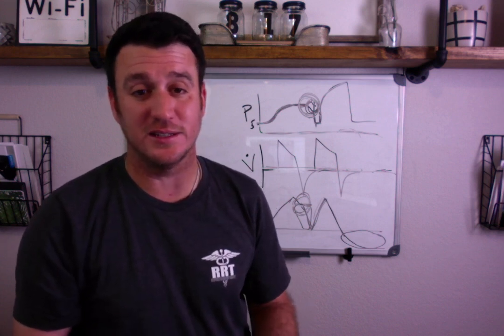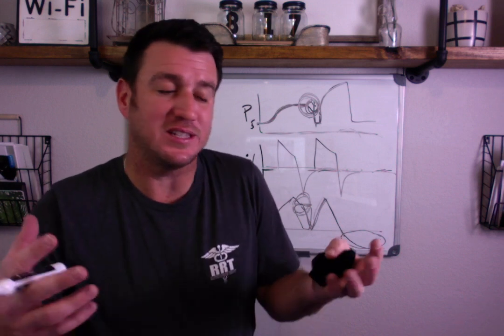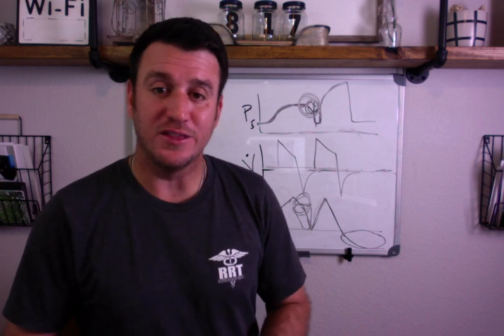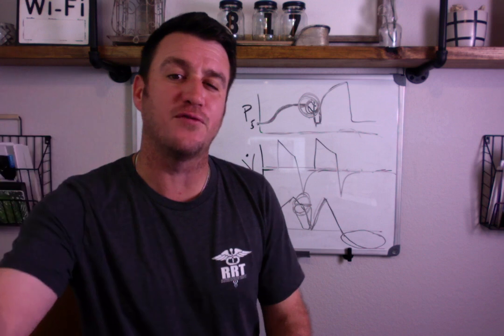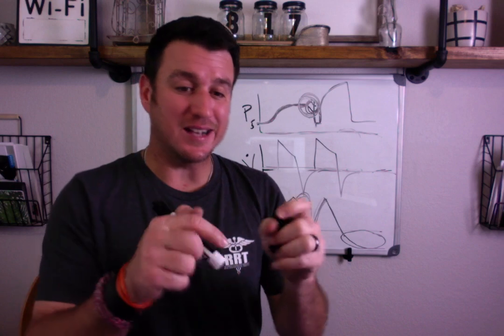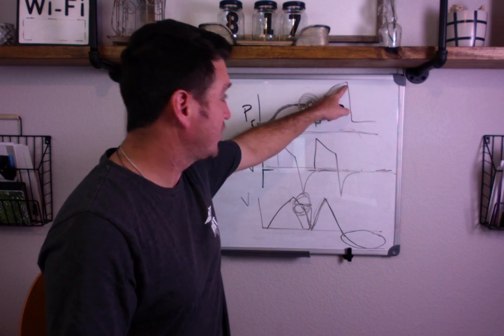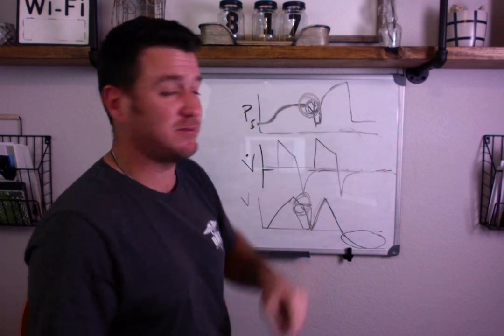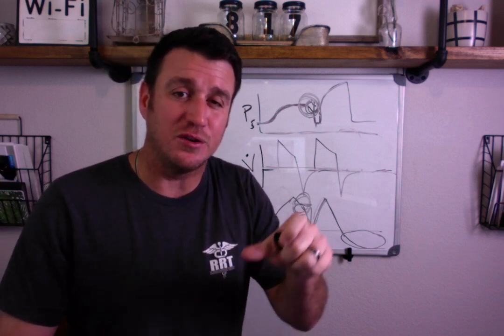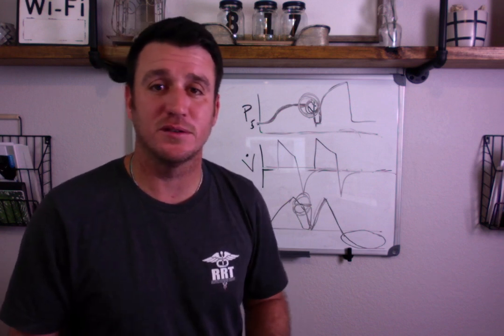Now the problem with this is that you have a patient who may be wanting a tidal volume in the ballpark of, let's say, 450 mLs. We have them set on 400. Their diaphragm is still dropping because they're wanting 450, but we're giving 400. Okay? The consequence to that is we get this steep increase in peak inspiratory pressure, which could possibly lead to barotrauma, just to give an additional 50 mLs to the patient. They want 450 mLs. That's how they're comfortable.